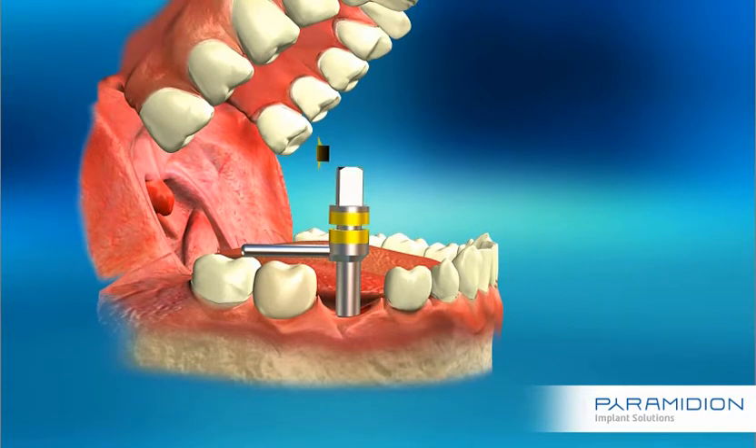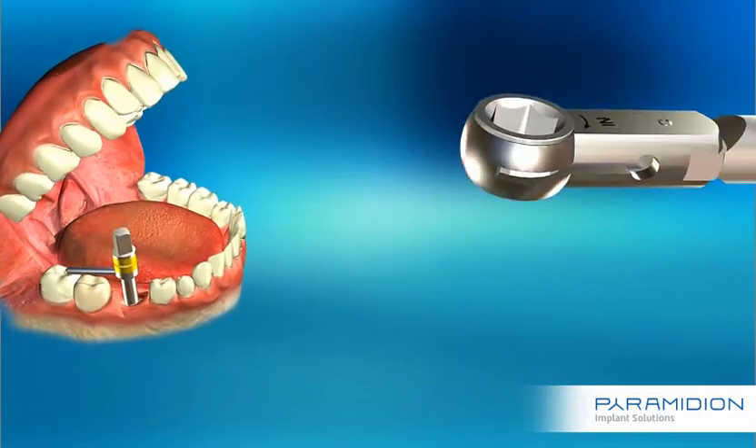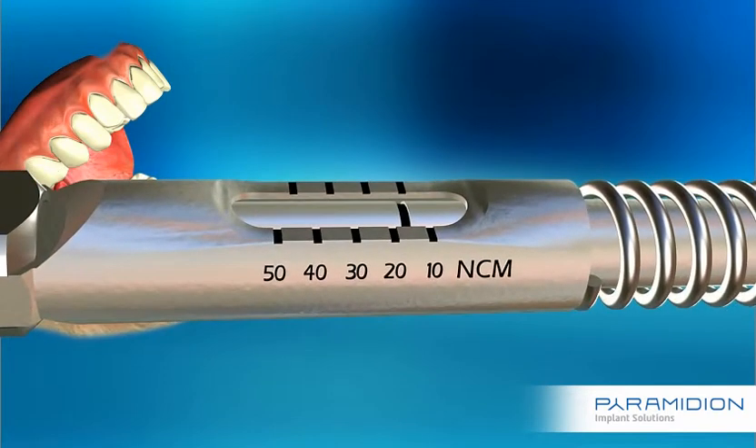Rotate the square head gently with your fingers until the expansion tool is engaged with the implant's internal thread. Change the torque ratchet wheel head before using it to expand the apical portion of the implant. Verify that it is set on 35 Newton centimeters.